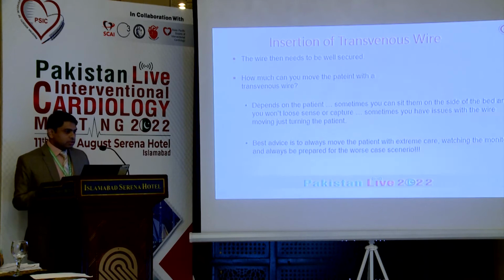After insertion, you should be securing the lead so it does not move. The movement of the patient will depend on the limitations. You should be counseling the patient that his movement should be restricted.